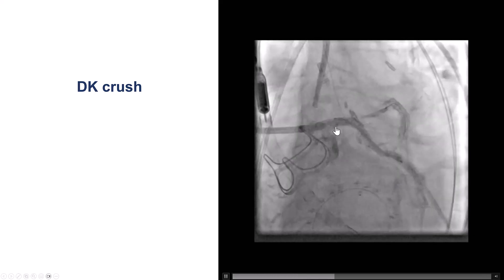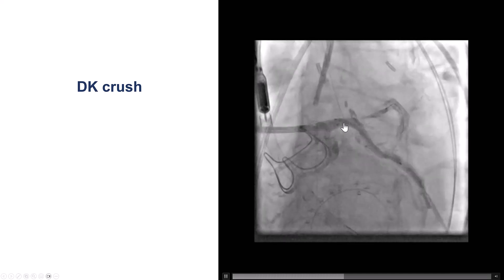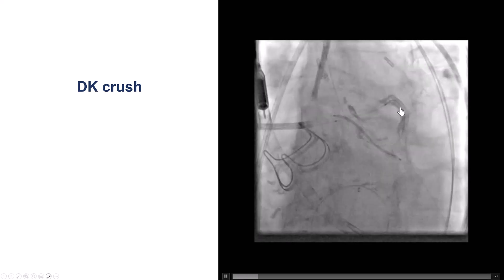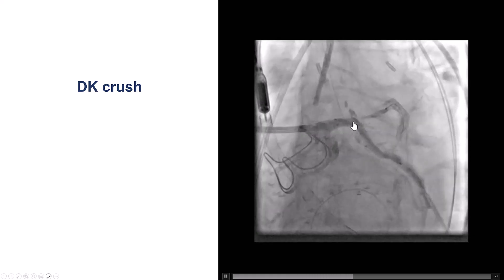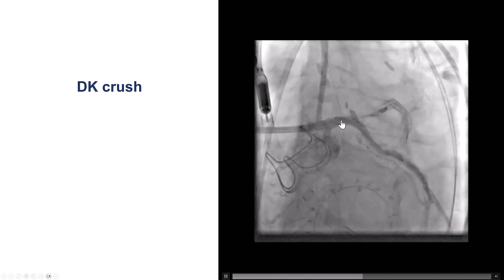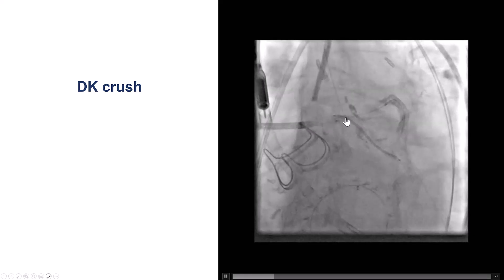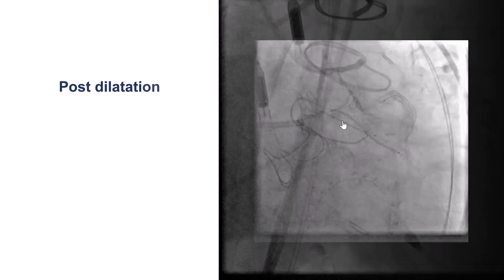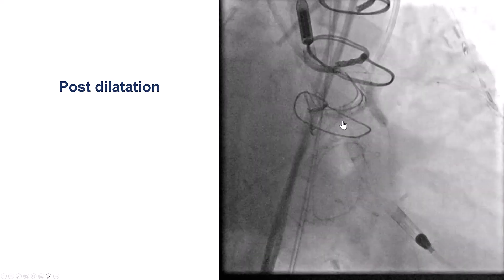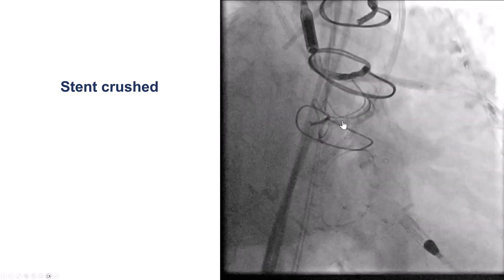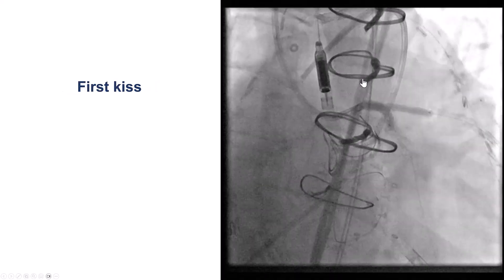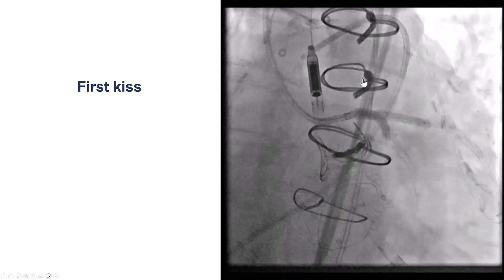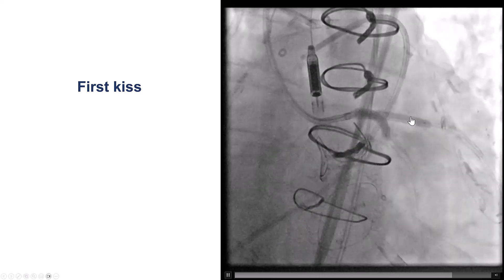We decided to use a two-stent technique for the LAD and the circumflex. The technique we chose was the DK-Crush. The nice thing about the DK-Crush is that you maintain access to the main vessel — the LAD here — which is also important because we do not want to jail the retrograde guide wire. We placed the stent into the circumflex protruding a little bit into the left main. The stent was deployed, post-dilated, then crushed into the left main, followed by rewiring of the circumflex and the first kissing balloon inflation. We see nice expansion of the stent.